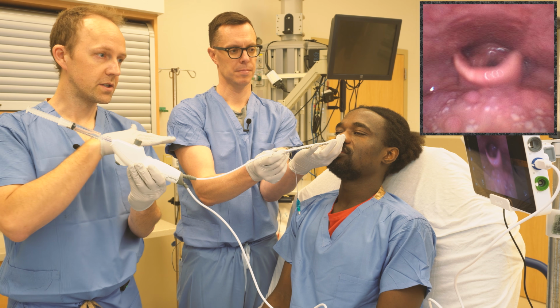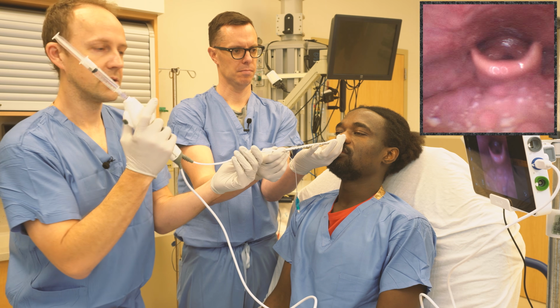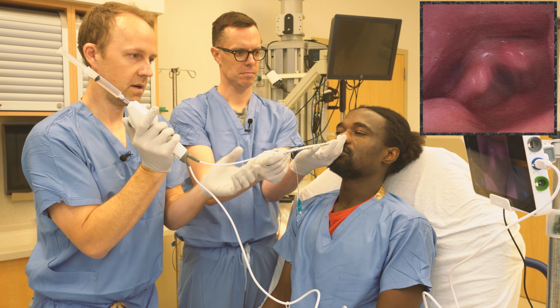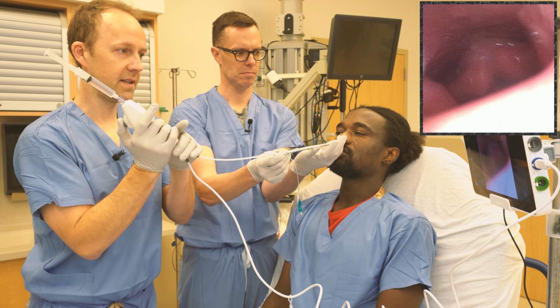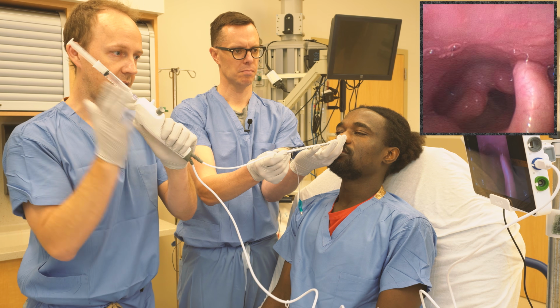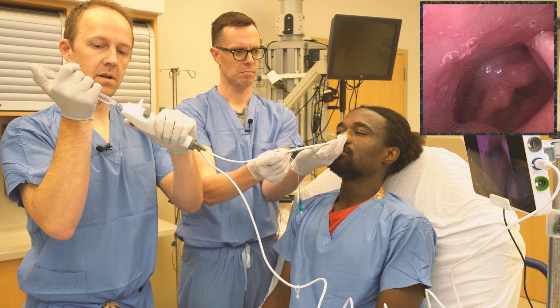This will go through the scope and basically go to where you're aiming on the screen. So I just want to center the vocal cords in my field of view here. And when this happens, this makes the patient cough a little bit, which is a good sign that you're getting into the right spot. So I'm going to put in maybe 1 ml here.